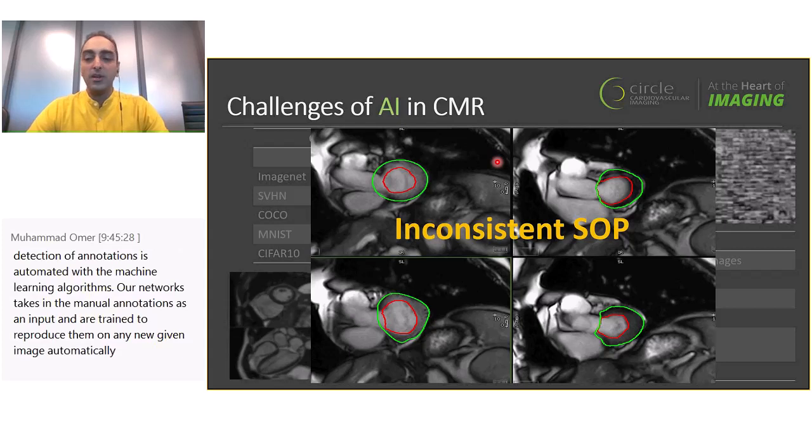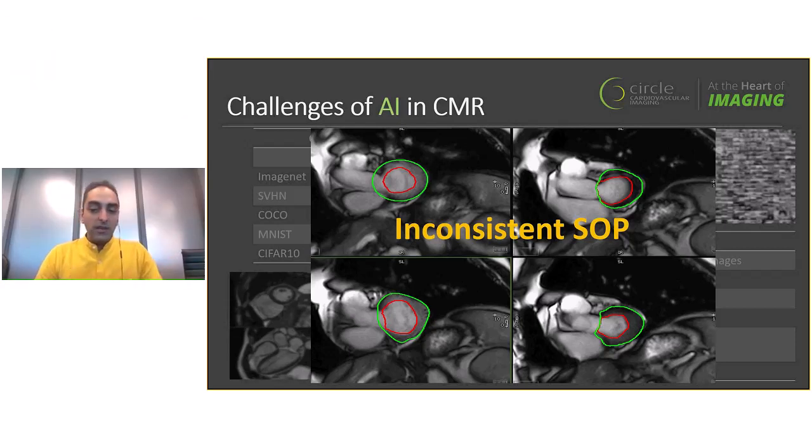Do we do some kind of combination of on-site learning and domain adaptation to essentially allow the user to annotate a few cases, and for our algorithms to learn how to adapt their contouring style to what they're being shown? If we decide to go that route, we face many challenges.